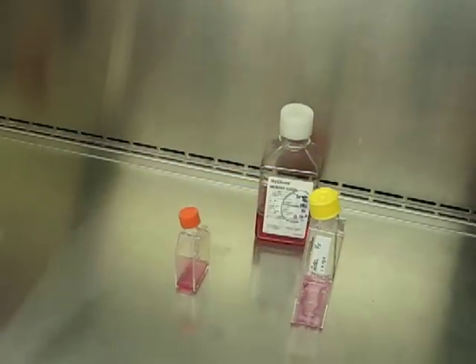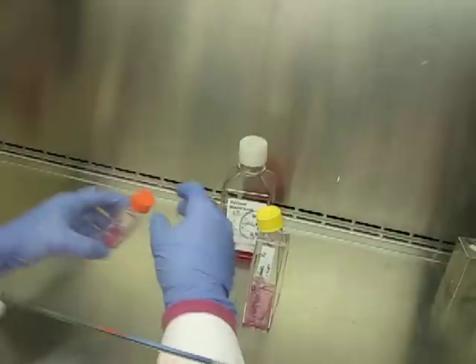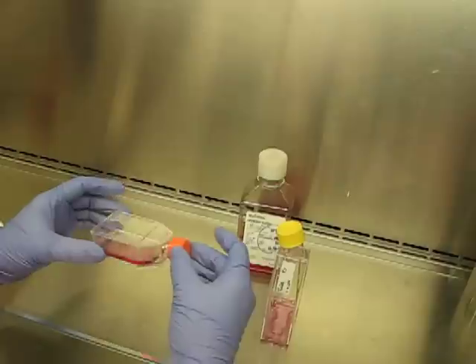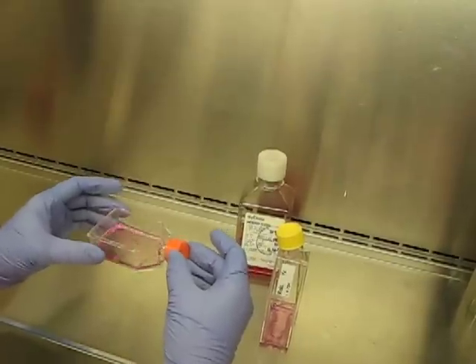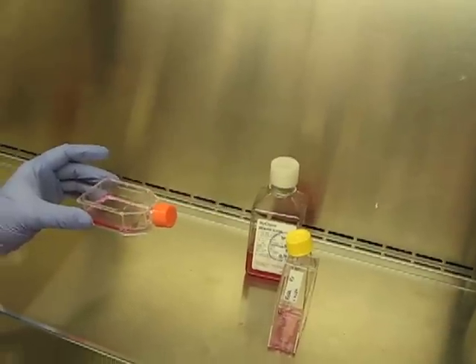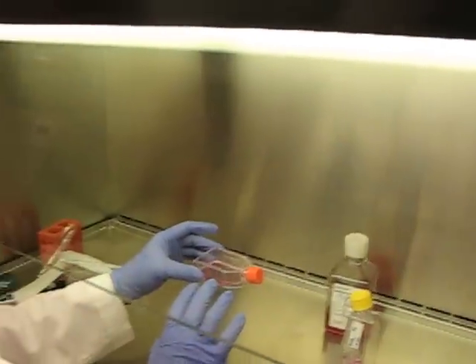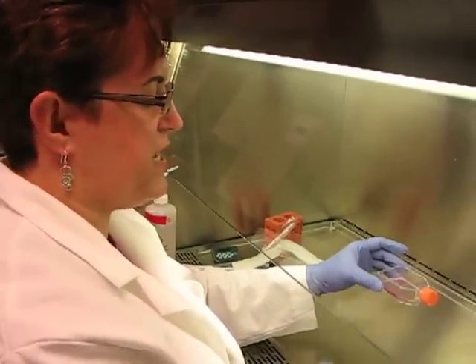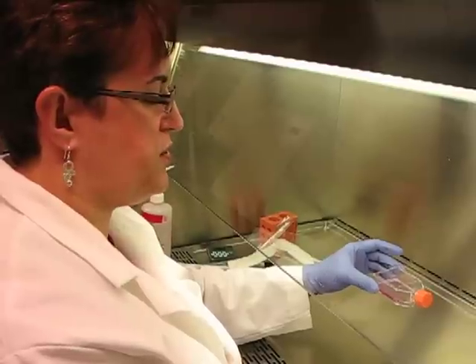Remove your pipette, close your cap, and gently tilt the media until it covers the surface. This is ready to go back into your incubator. HeLa cells will attach in about six hours — they will all be attached and then you'll be ready to do your experiments.